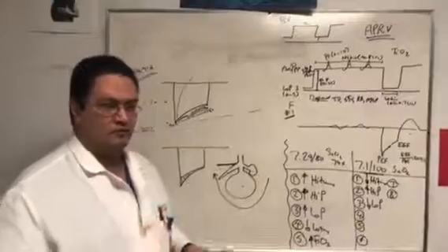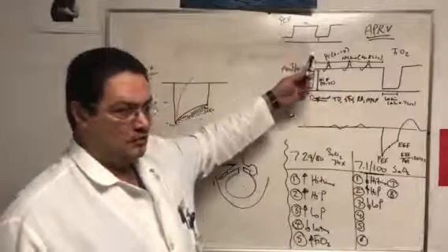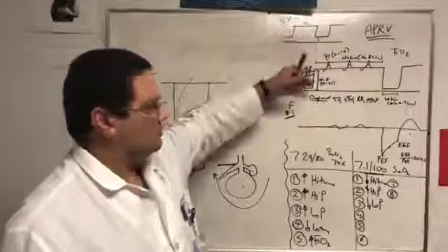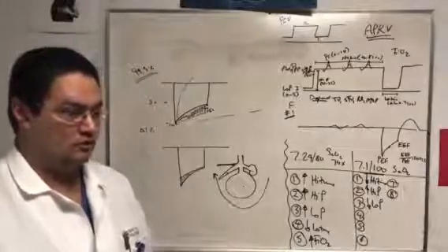So you can go from 5 to 0, and you can actually keep it at 0, as long as you're watching the ratio. So you go up here and you go down there, and by going from 30 to 35, and this is from 5 to 0, you increase the delta pressure by 10, so more tidal volume.